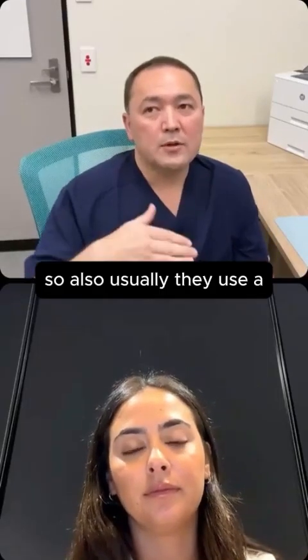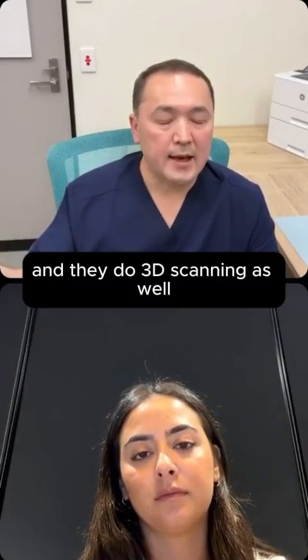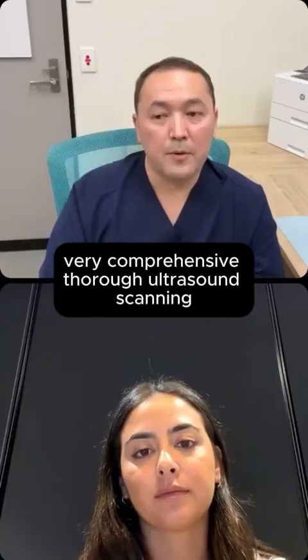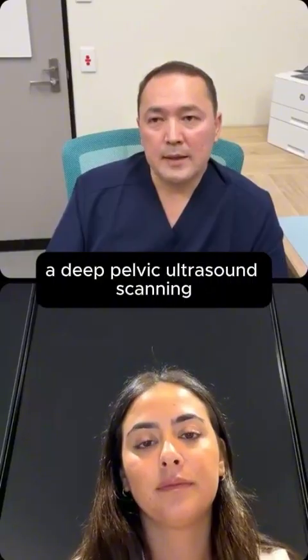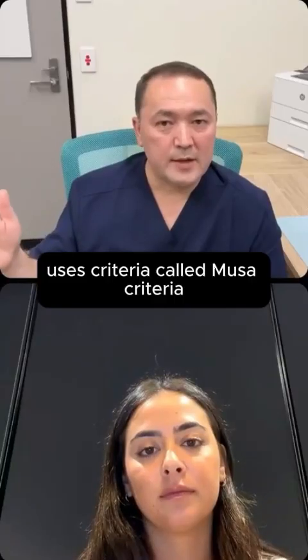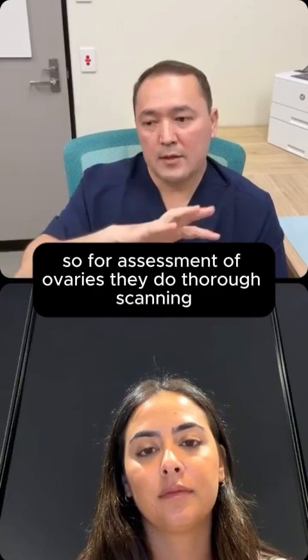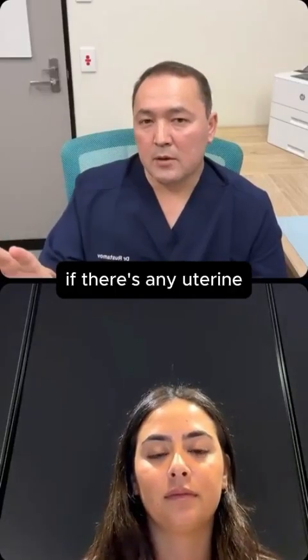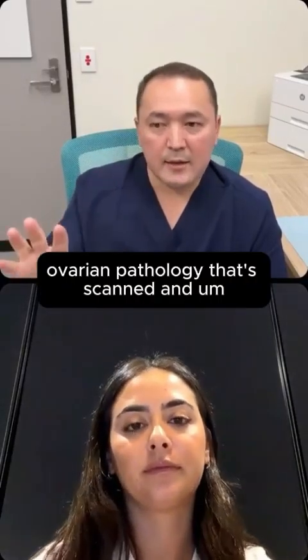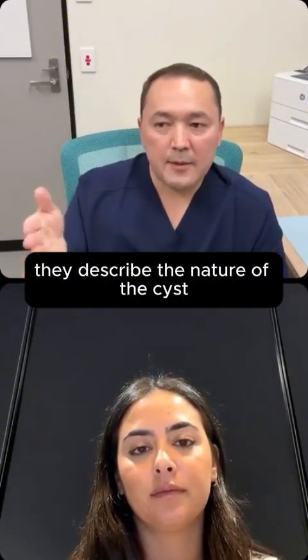Also, they generally use much more powerful machines, and they do 3D scanning as well. So that's a very comprehensive, thorough ultrasound scan. And deep pelvic ultrasound scanning uses criteria called MUSA criteria for assessment of the uterus. For assessment of the ovaries, they do thorough scanning, and antral follicle count is included. If there's any uterine or ovarian pathology, that's scanned. And let us say you have an ovarian cyst, then they describe the nature of the cyst.